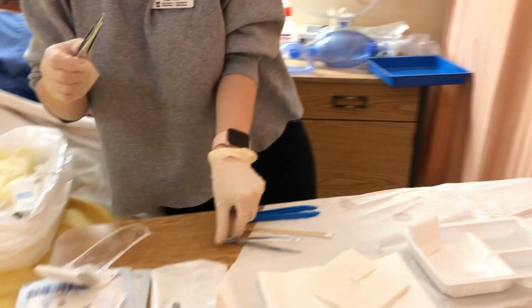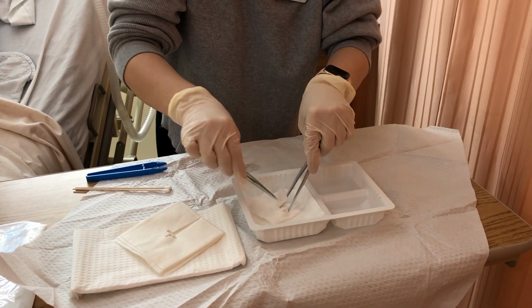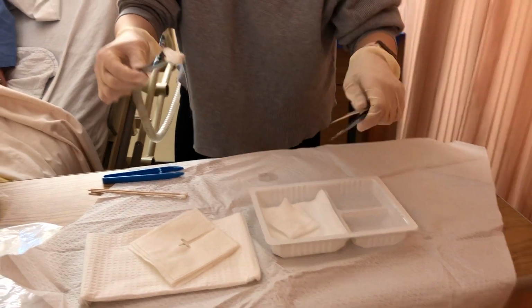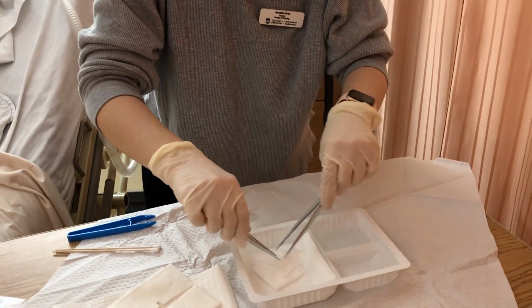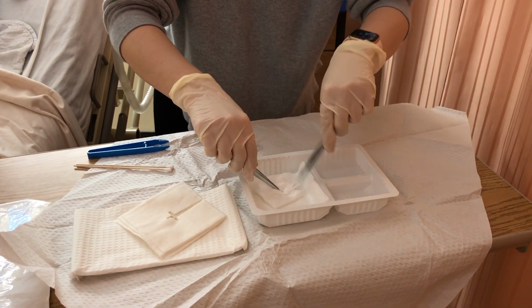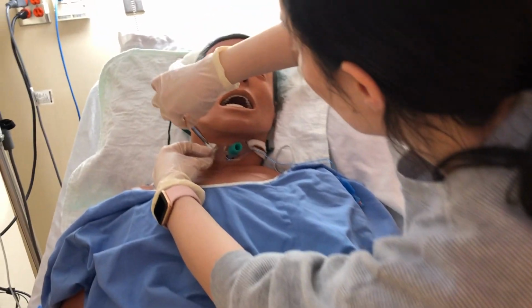Good. And now I'm just going to dry. And dry the top.